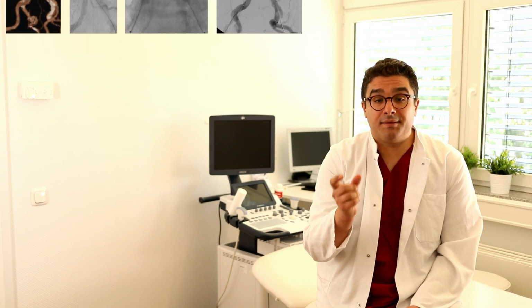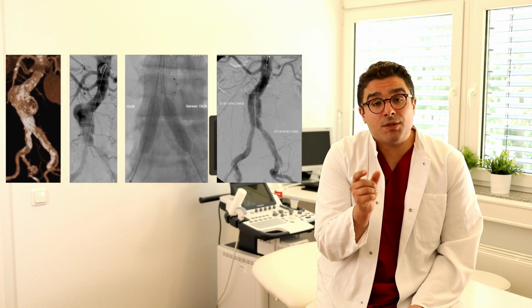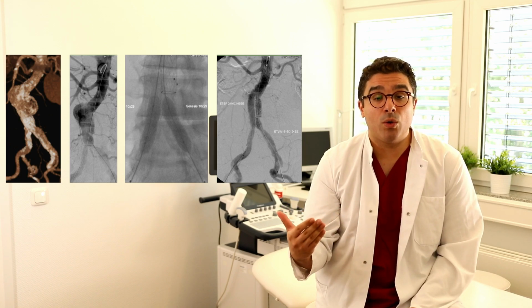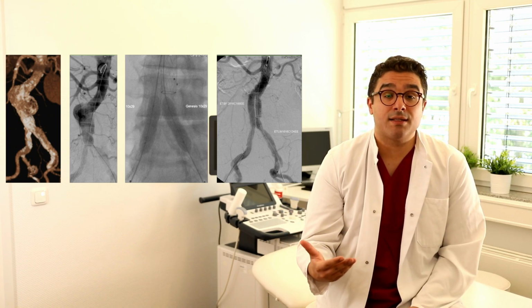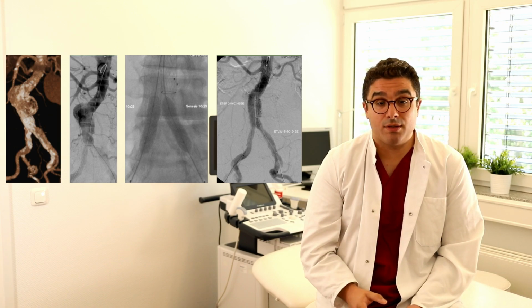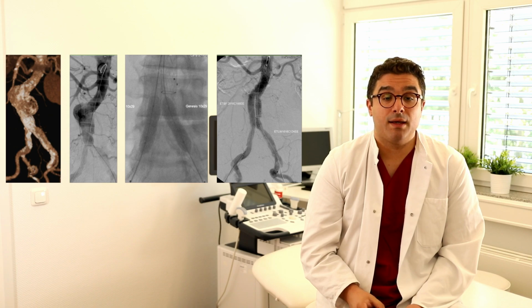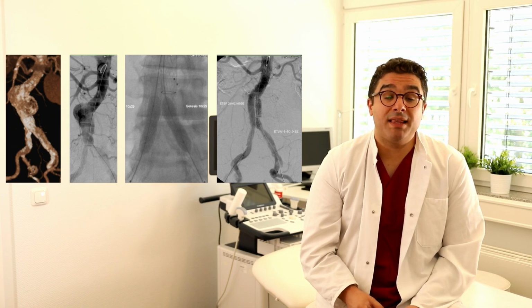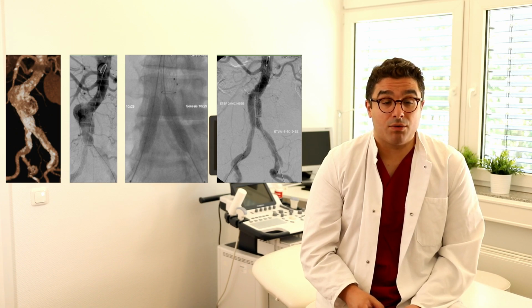Finally, do not forget to measure the distal neck, and in case that you consider that it is too narrow, like in this case for your limbs, just order also balloon expanding stents to implant them in kissing technique upon the results of the final angiography. We have confirmed the efficacy of this technique to keep the limbs patent in the long run.